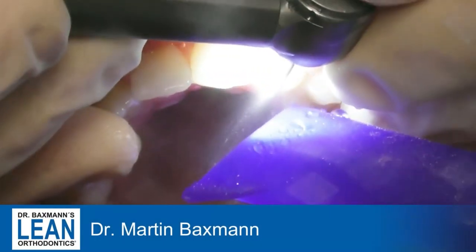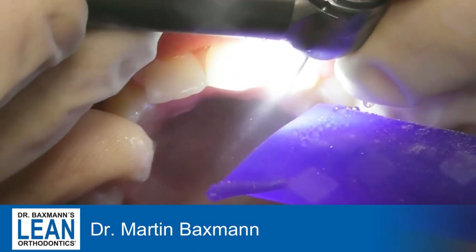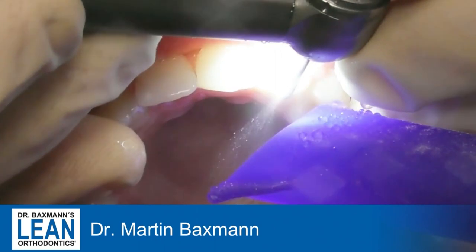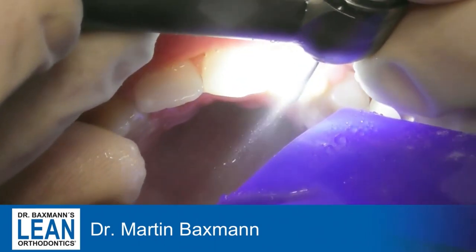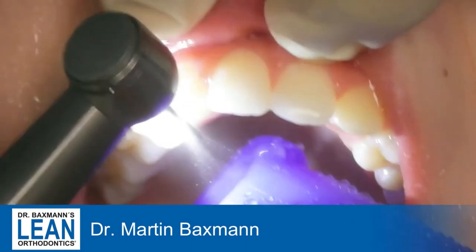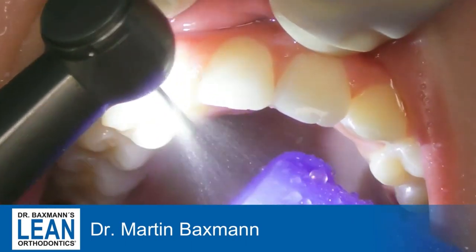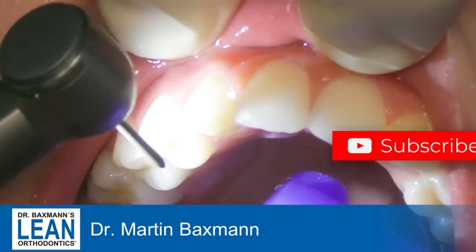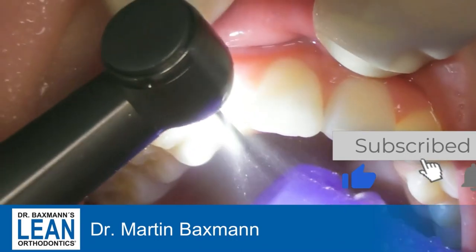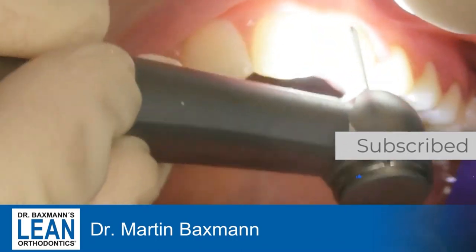It's quite rare that we can use a burr as an orthodontist, but there are certain cases where it's really a sensible idea to do that. For example, when we have missing upper lateral incisors and we are placing the canine in place of them. Then we have the four instead of the three and we have to remove the palatal cusp. We need to reshape the canines and that will give a really nice look.